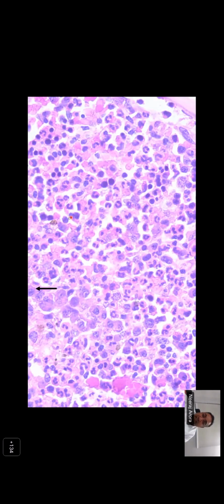So further evaluation showed that this paraprotein was IgG type, and now we were evaluating that this is a case of Hodgkin lymphoma with paraproteinemia, and this is a retrospective bone marrow biopsy. Can anyone see some things here, or try to see what are the things being highlighted by the arrow? So these are the plasma cells? Yeah, these are all the plasma cells which we had initially missed out.